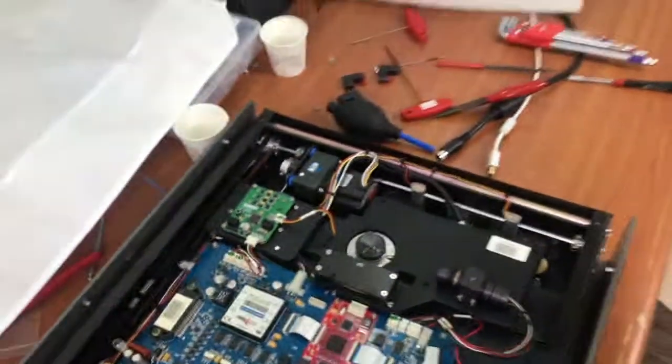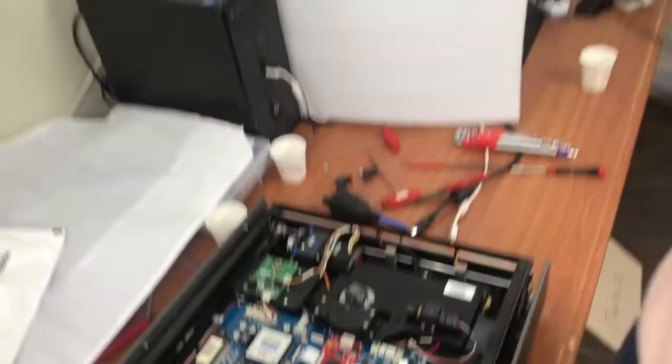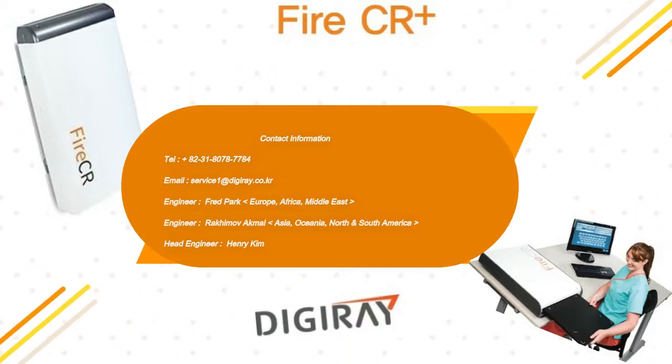Okay, so this is how to clean the fiber bundle on the scanner. Thank you so much for watching the video, and I hope everyone stays safe from the COVID-19 virus.